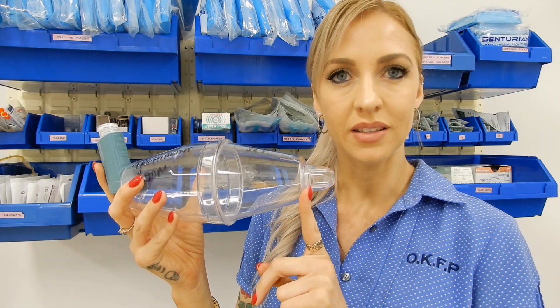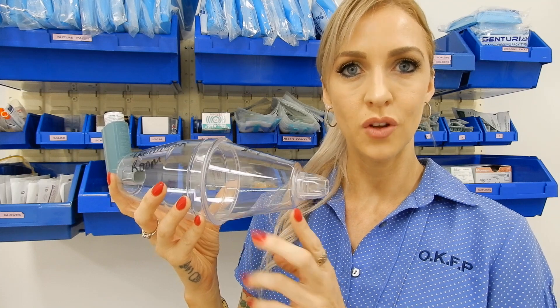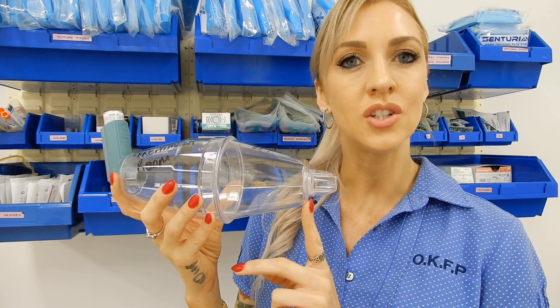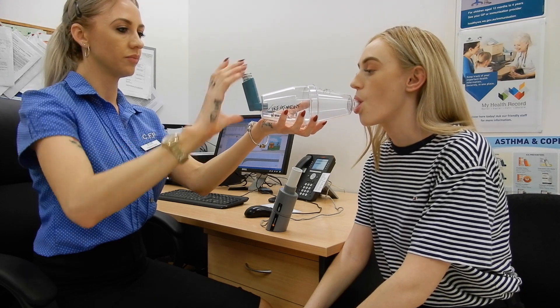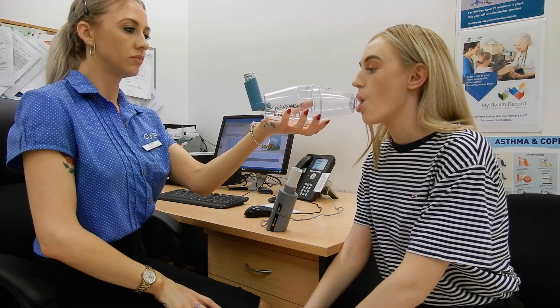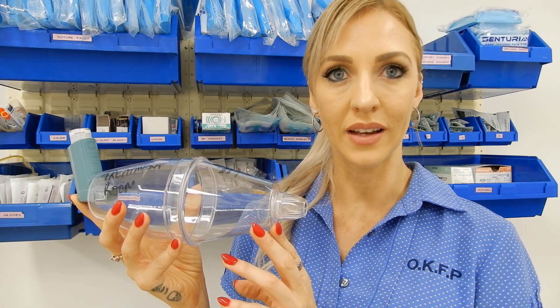There is a valve at this end of the spacer which prevents the medication from escaping. Once your lips are sealed firmly around the mouthpiece and the medication has been administered into the chamber, breathe in and out through your mouth and keep doing this until the nurse asks you to stop. This allows the salbutamol to diffuse down into your lungs.